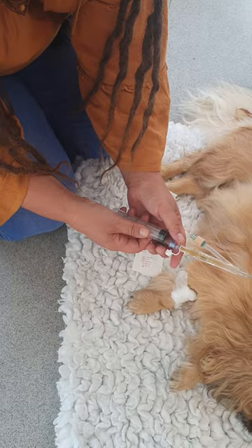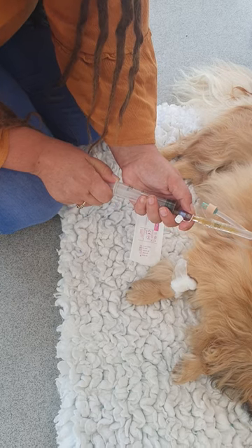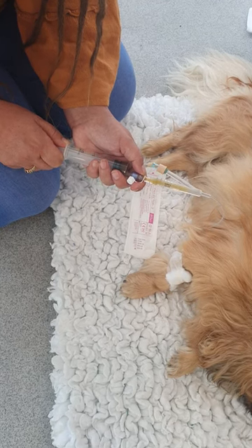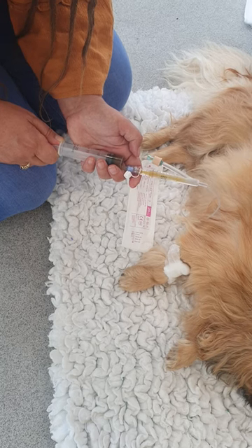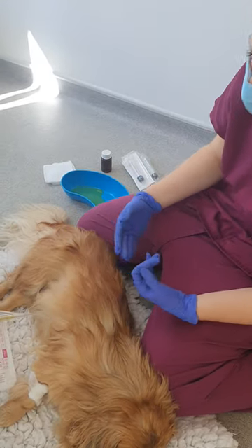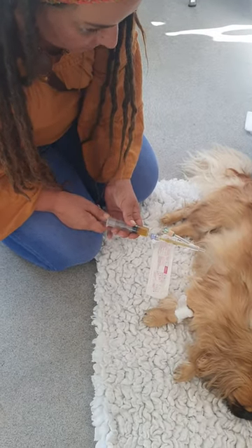So we've got her. We've got more but we've not got any other information. Once it's too resistant, then we can stop, and I'll have a little feel and it should be empty at that point. But that looks okay for now, so you can keep going.